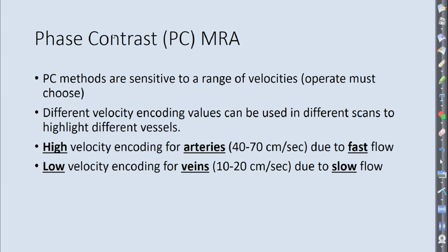So since we're trying to do an MRV, which one are we going to use? A lower VENC or a higher? If you're trying to visualize for an MRV. High. Low. Low. So low VENC because we want to visualize veins.